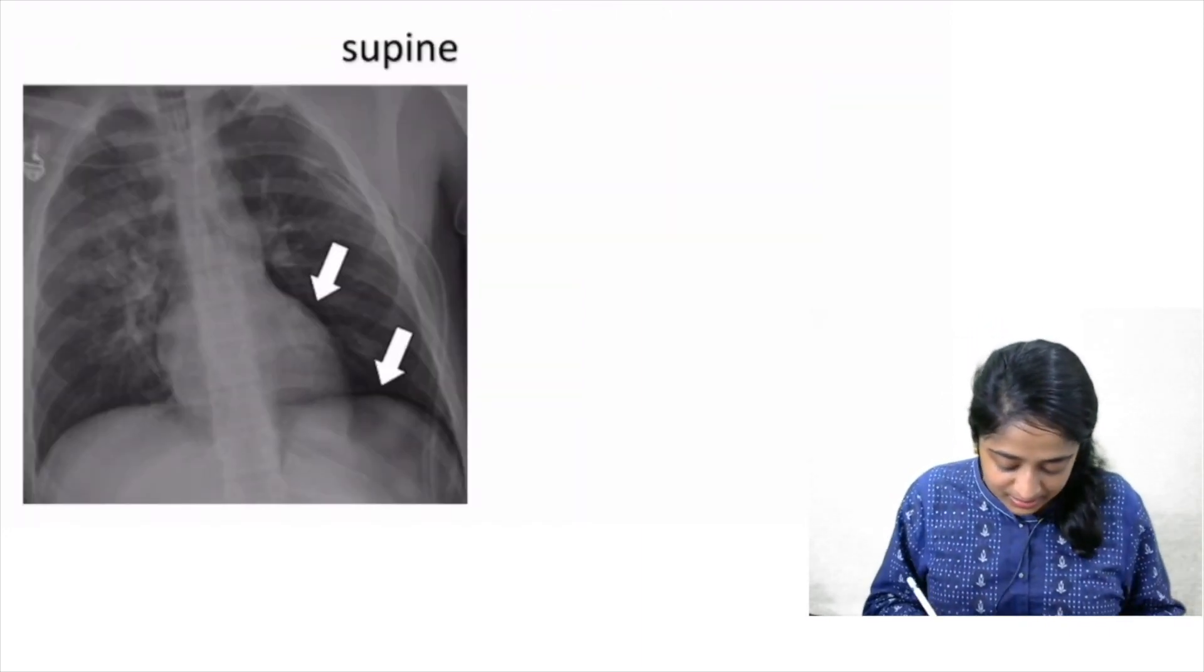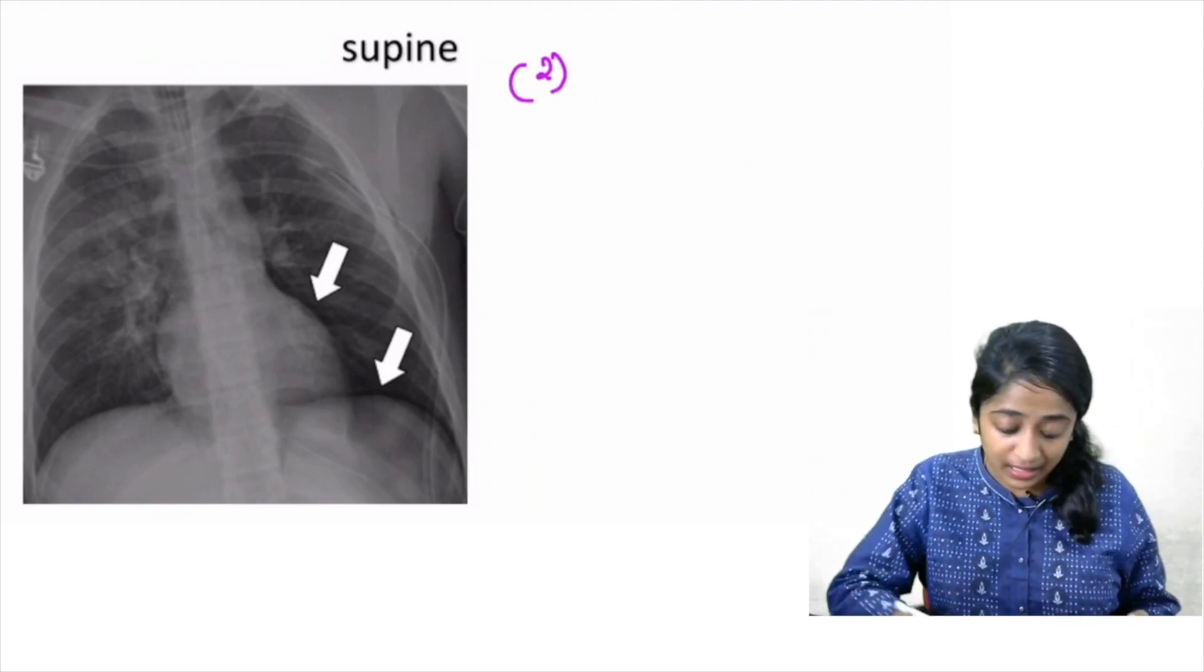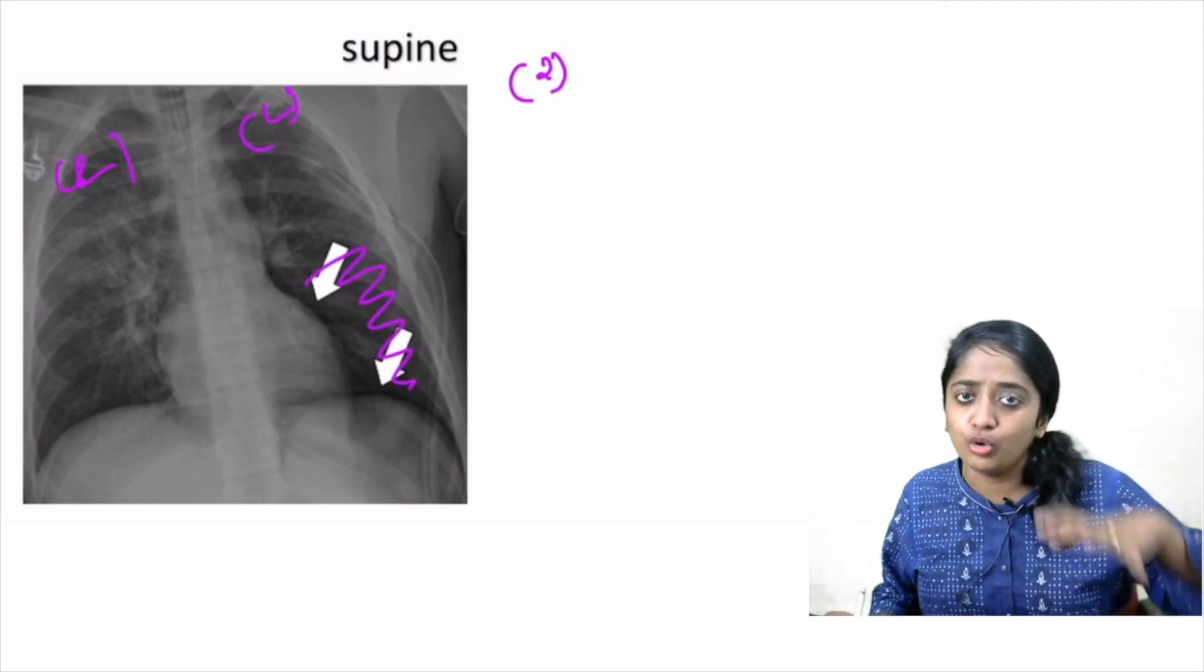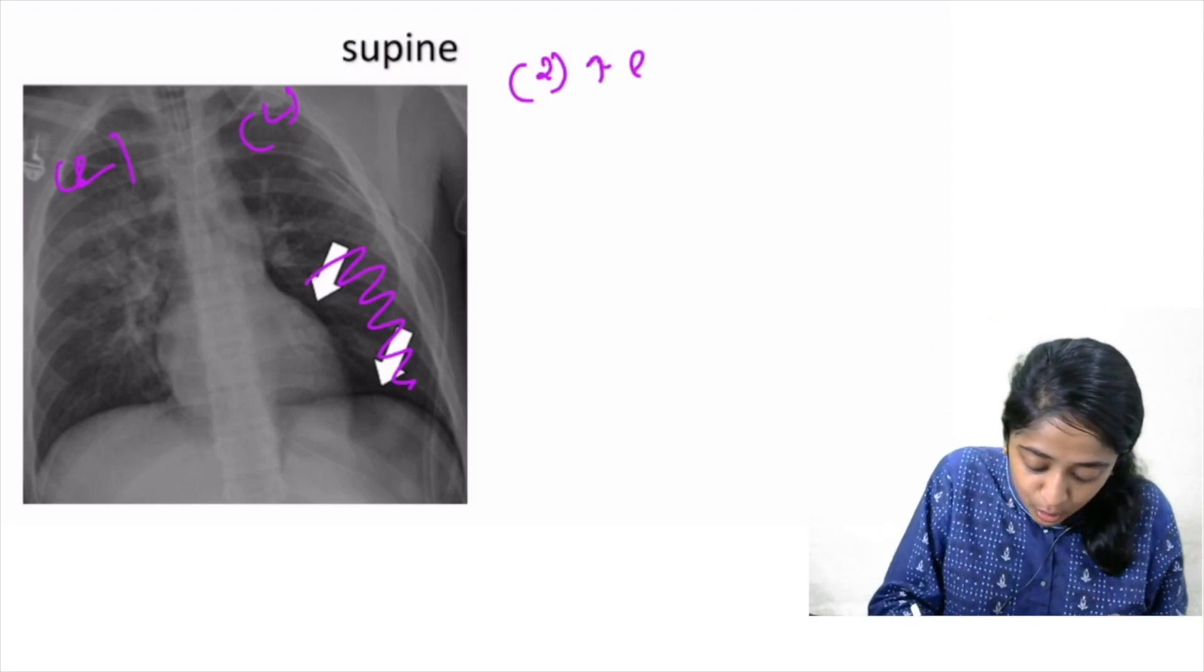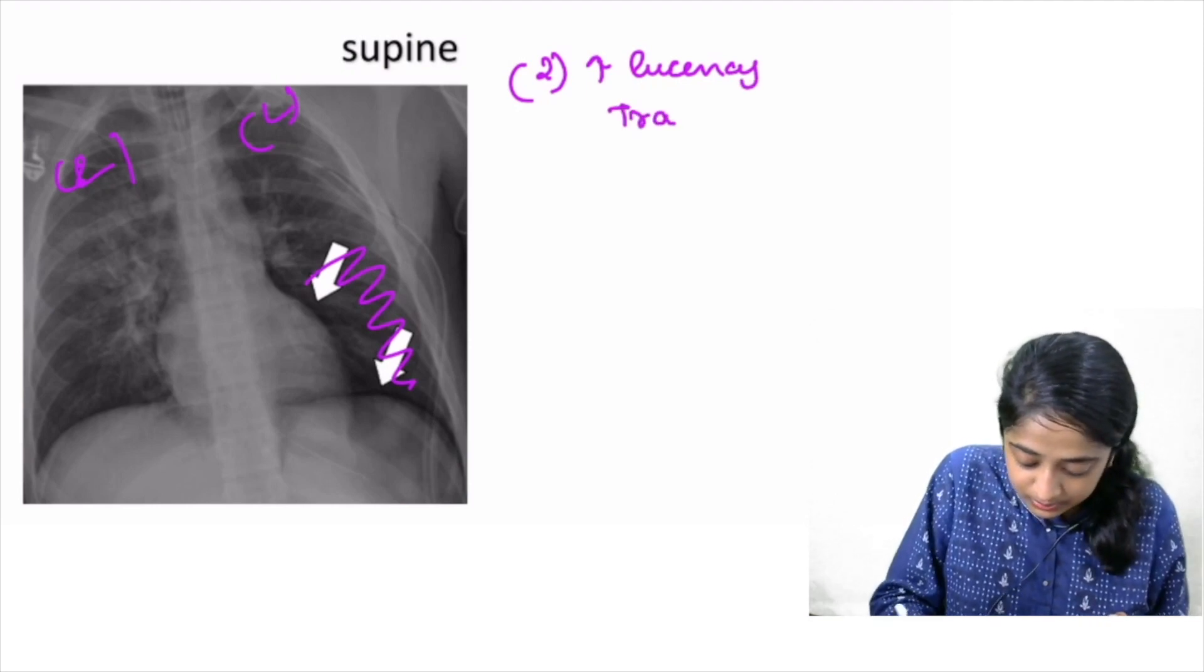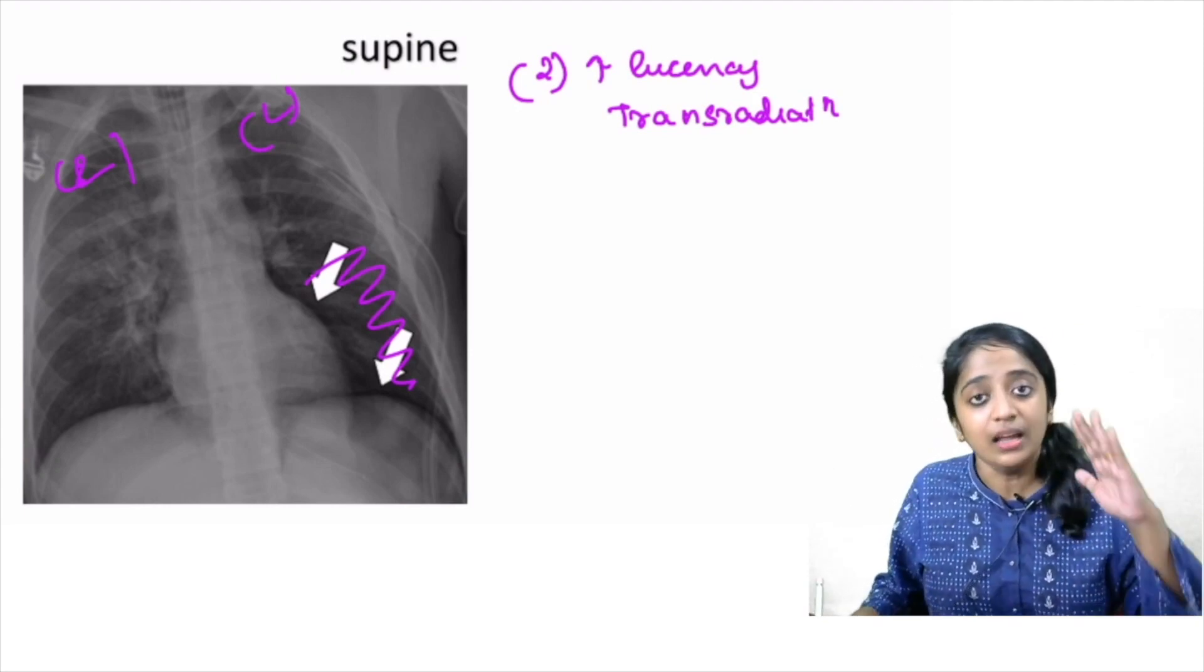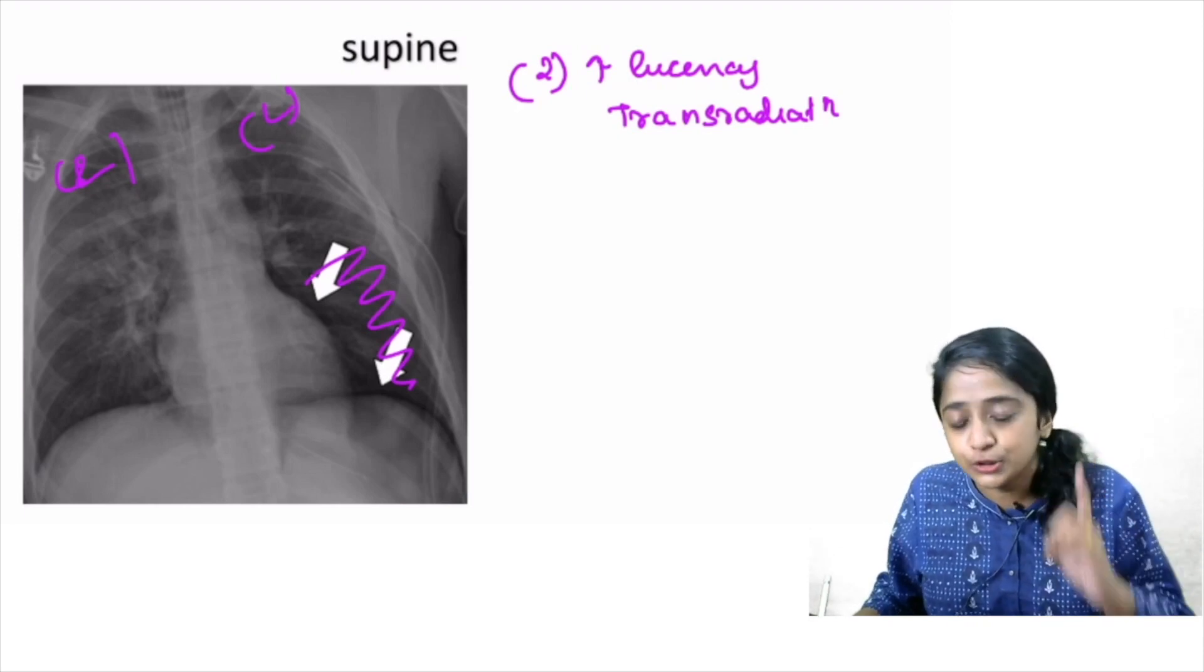Now let's see the second sign of supine radiograph. So look at the radiograph given to you. Compare the right and the left side. You can see that the lower lung field on the left side is much more lucent, that is transradiant. So increased lucency or transradiancy of a hemithorax. Transradiancy of the hemithorax in suspected case of pneumothorax is an evidence of pneumothorax on supine radiograph.